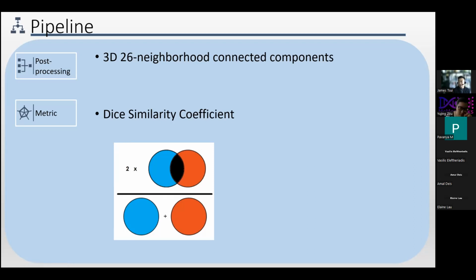To answer your question, Reza, it's not a PET CT. It's just when I combine all the three different Hounsfield unit windowing, it looks like what you saw there.